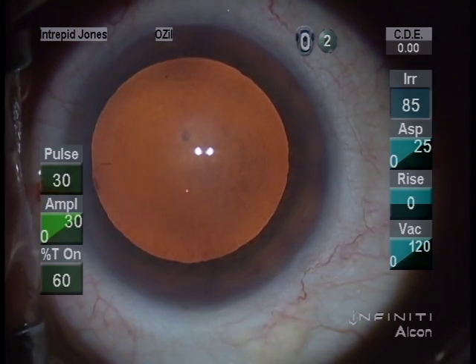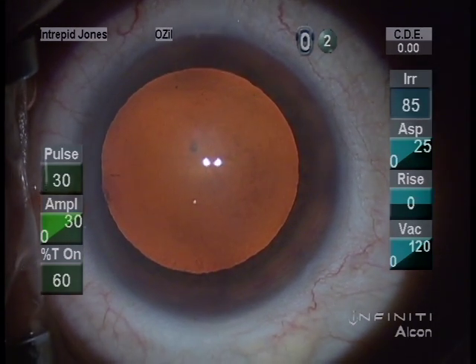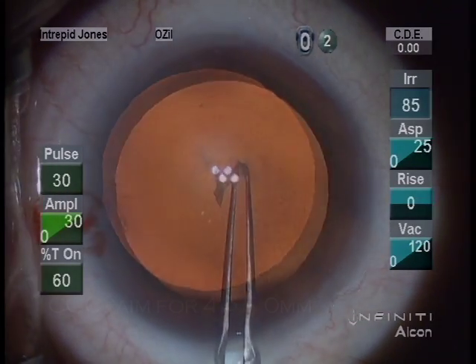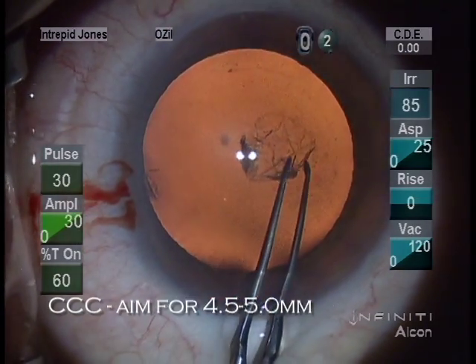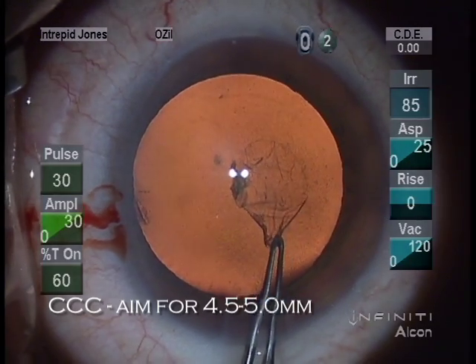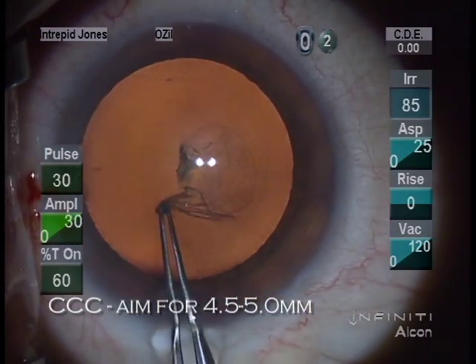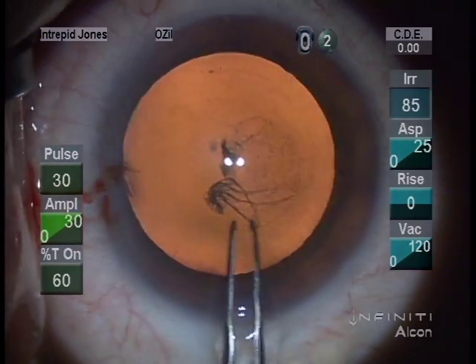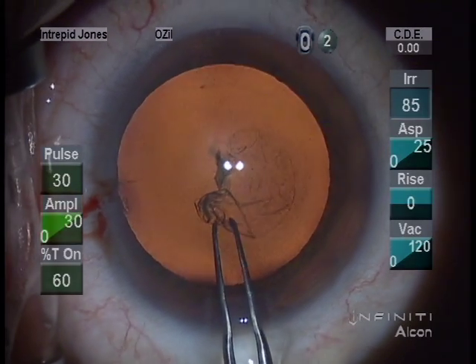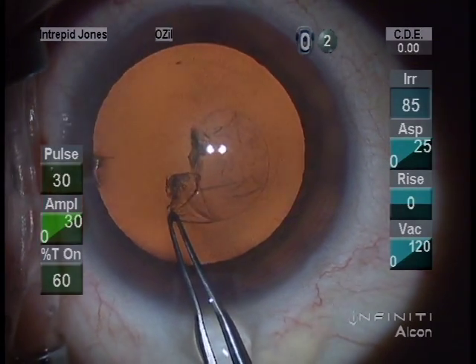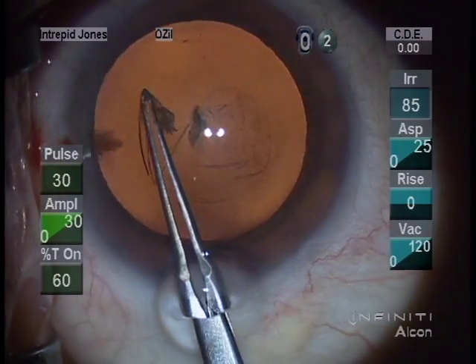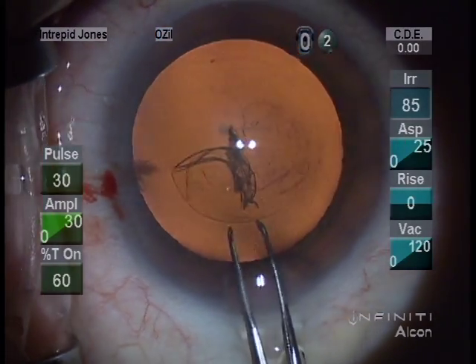I like to ensure that I have a complete fill of viscoelastic, in particular Viscoat, in the anterior chamber by exchanging the aqueous for the viscoelastic agent. This is best done with a bolus, begun across from the paracentesis, and backfilling.